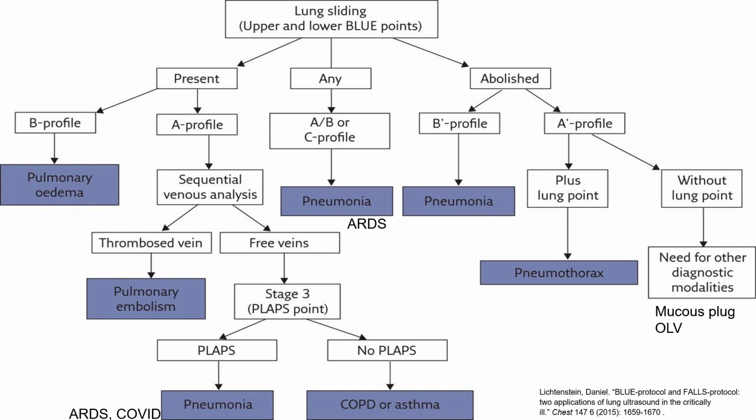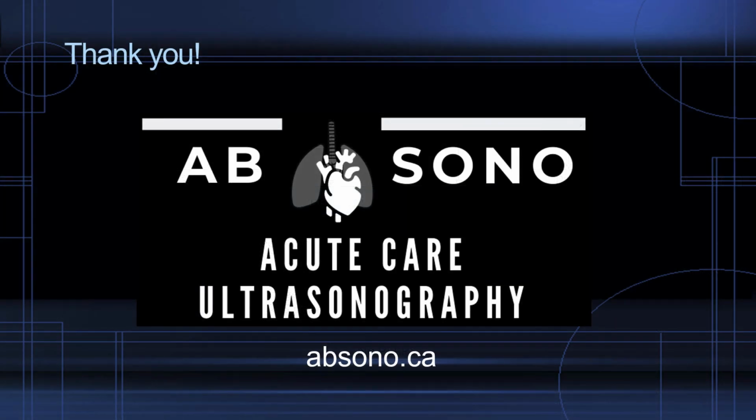All in all, with just a little bit of practice and understanding of the main lung artifacts, this should take no more than 5 minutes before you can start to more effectively and accurately treat the common and dangerous causes of your patient's respiratory distress without having to wait for other imaging. I encourage you to be opportunistic and practice this technique when occasions present themselves. Lung ultrasound is almost as quick to learn as it is to execute and is very high yield.